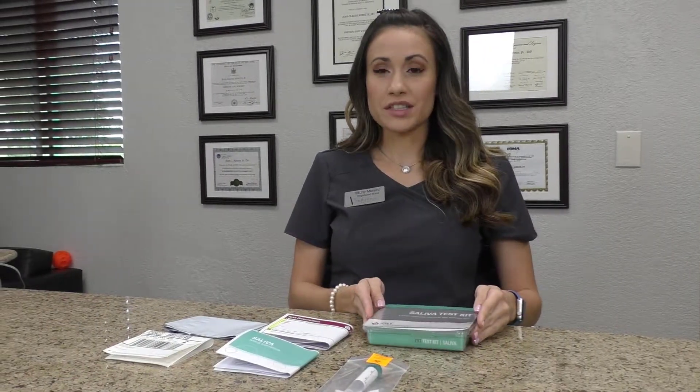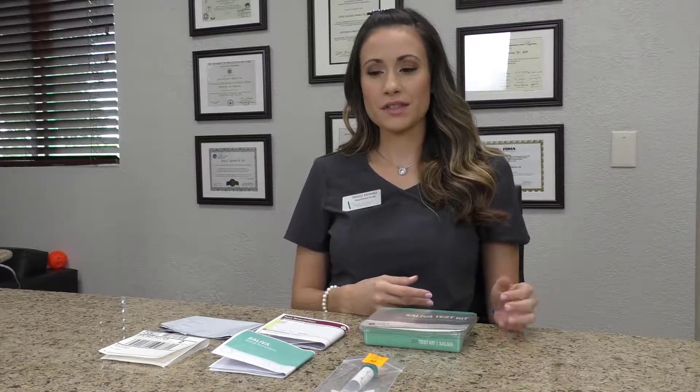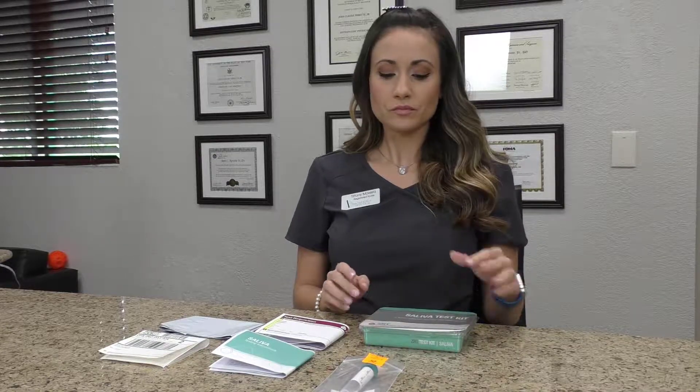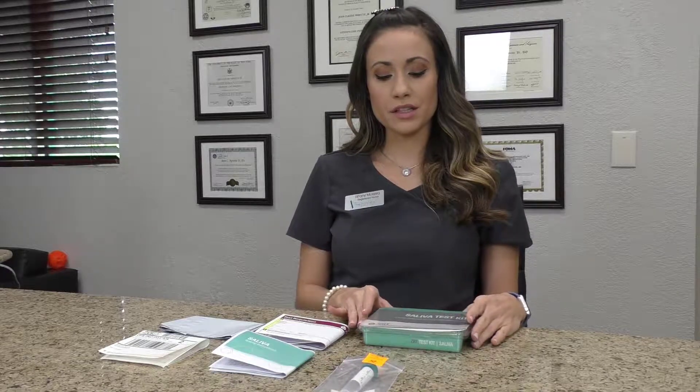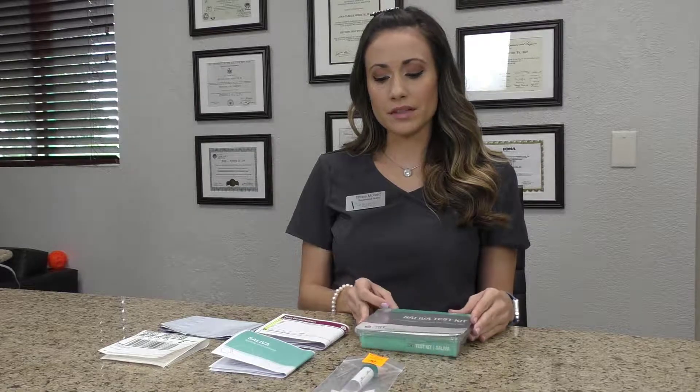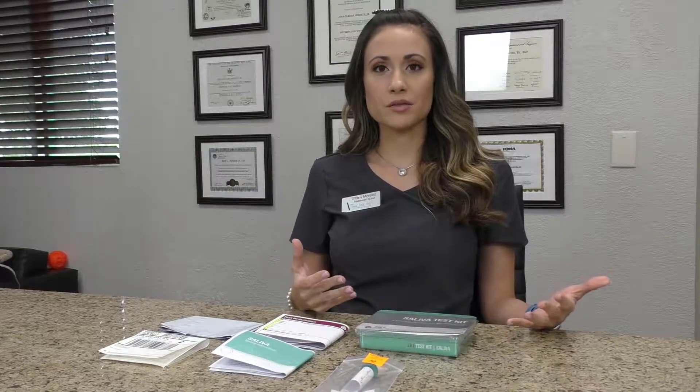When you take a saliva sample, you're testing for your hormone levels when you use creams — this is testosterone, estrogen, and progesterone. The best way to see how the hormones are affecting you is to test using our saliva kit. The best option for testing hormones is always through saliva when you apply them by creams, not through your blood.